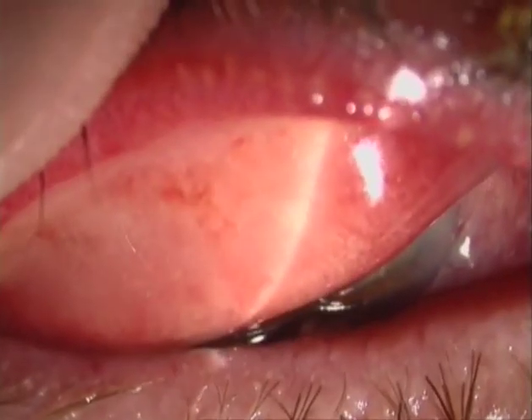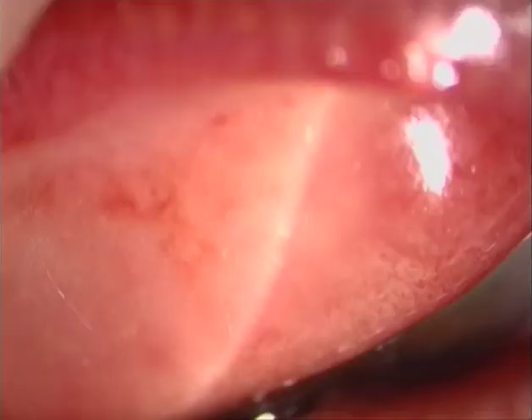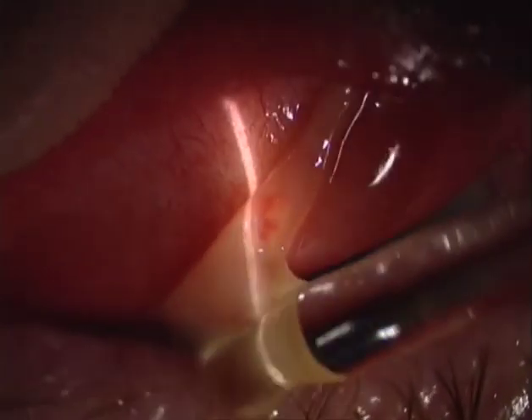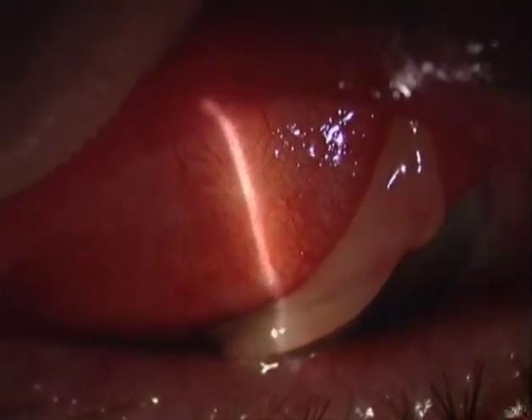And in the upper lid, the thick membrane obscures the underlying tarsus completely. No tarsal vessels are visible, and just some trapped ointment droplets appear in indirect lateral illumination. The membranaceous layer can be removed easily. No visible traces are left, and we see just a moderately inflamed conjunctiva.